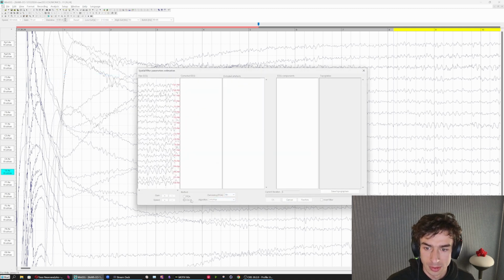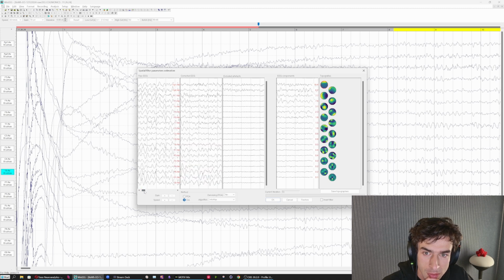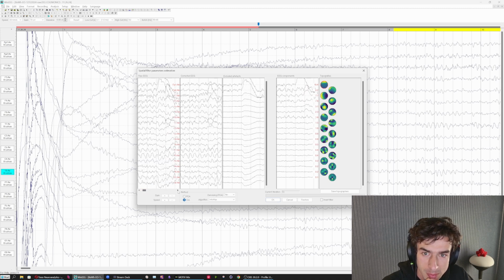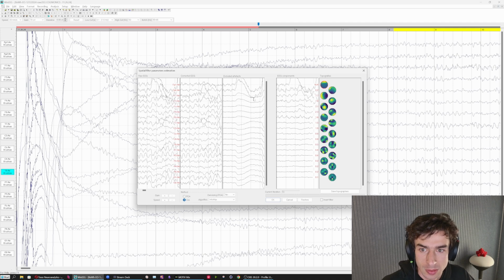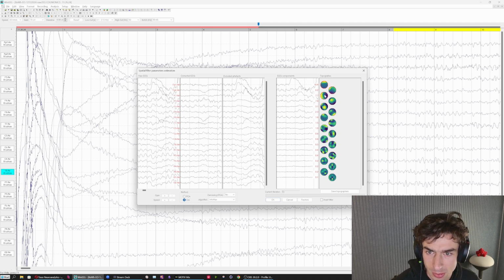We're going to use the standard Infomax ICA algorithm and see what we get. Oftentimes the first component is an eye blink component, so now we are going to vet that component. And we do see that this is eliminating a majority of the frontal eye blink deflection. And this is an interesting epoch right here because we also have lateral eye movement included here. And I am skeptical if we're going to be able to get that component out with what's being decomposed here.